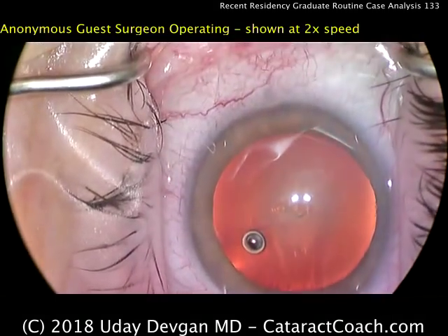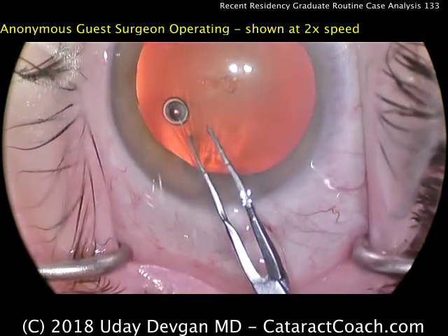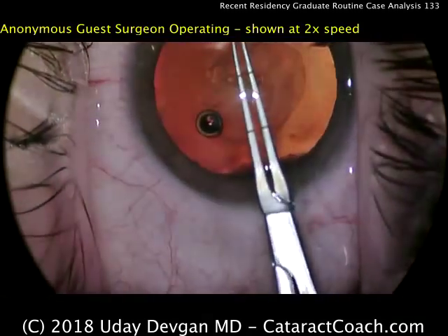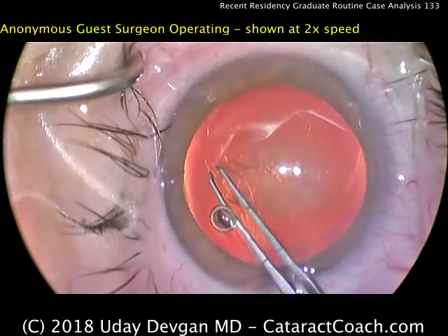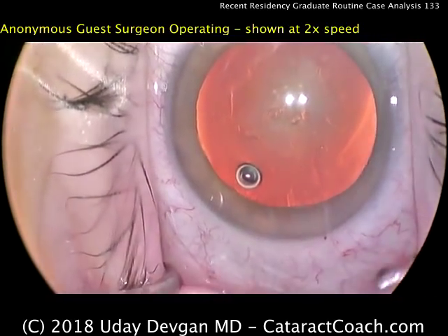At this level of training, the resident probably only has a few hundred surgeries under the belt. The rhexis is being constructed — that looks great. Again, this is two times normal speed, and that's a nice, round, well-positioned capsulorhexis. I like it.